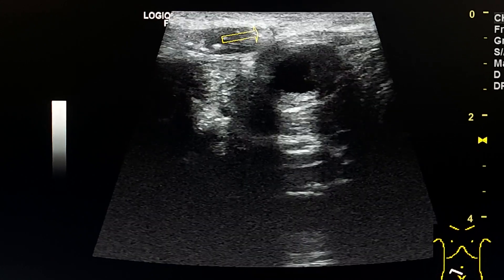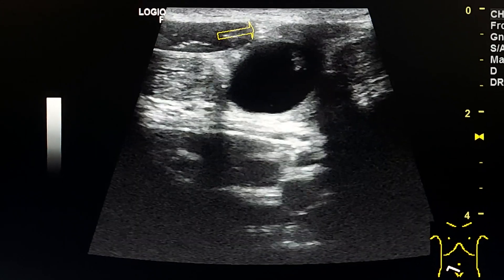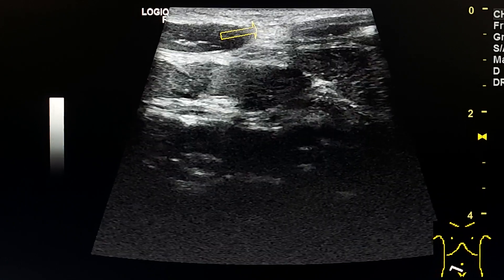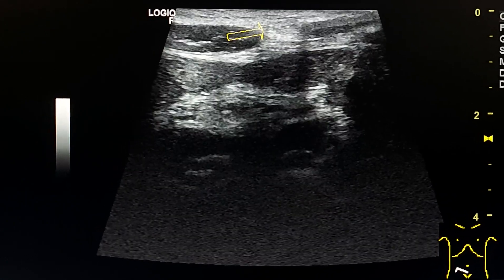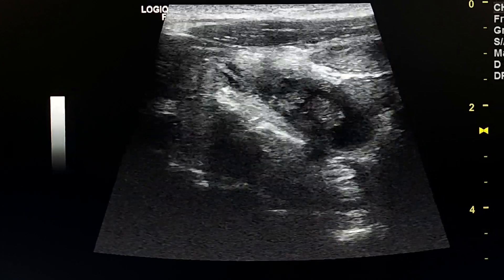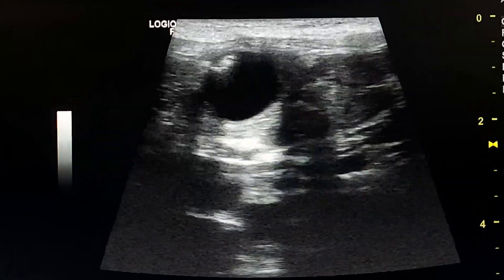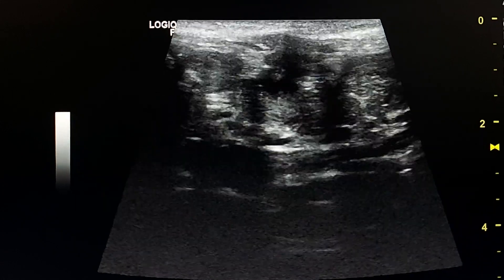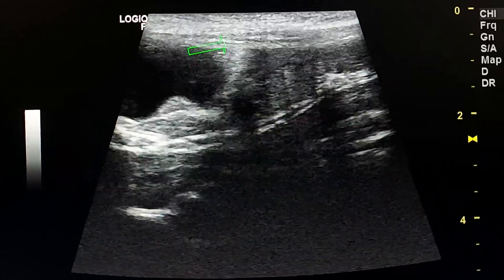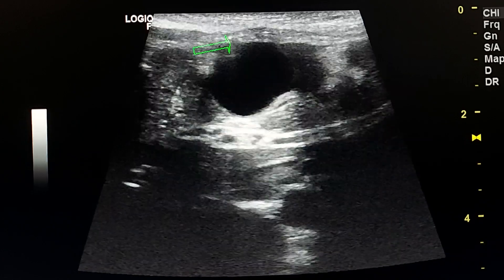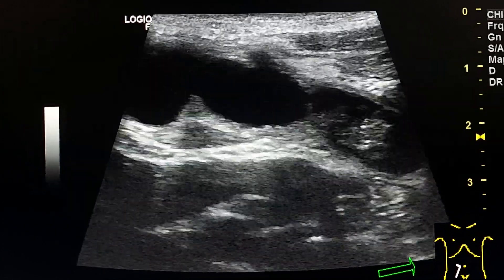Then it goes deep in the right aspect of the pelvis. This is the attachment to the umbilicus of the distal end of the diverticulum, shown in a longitudinal section.